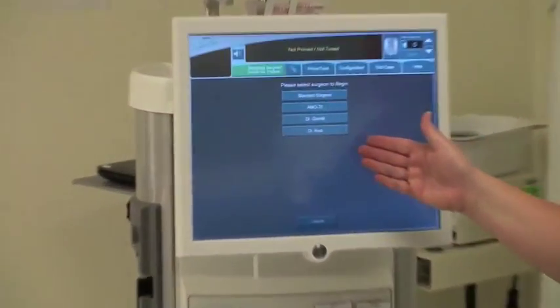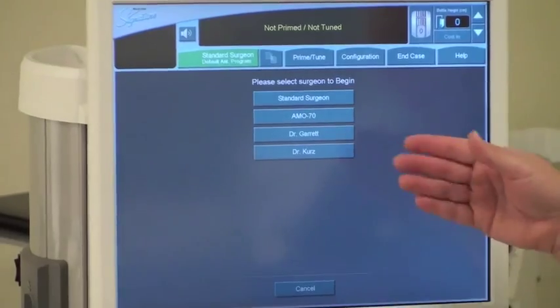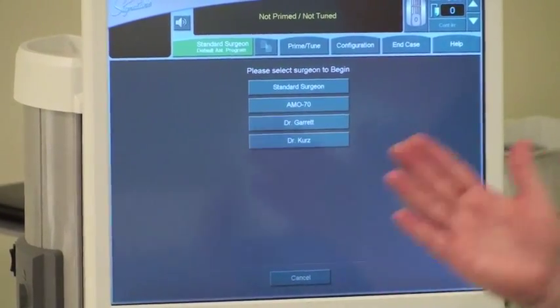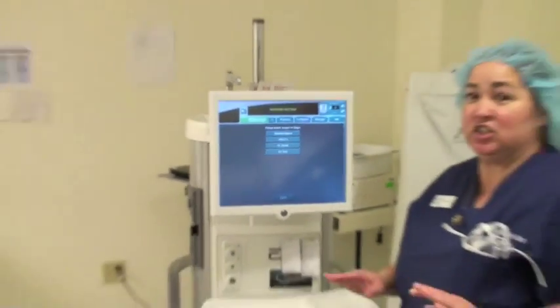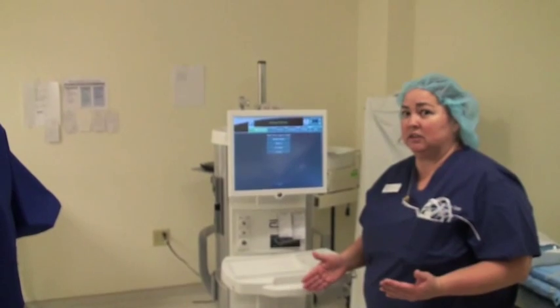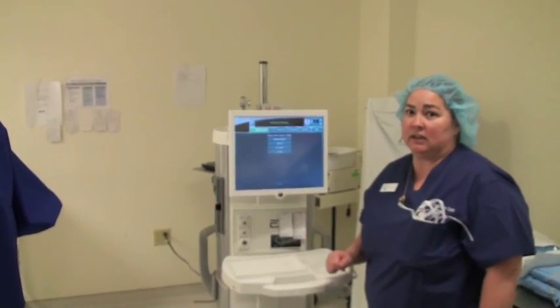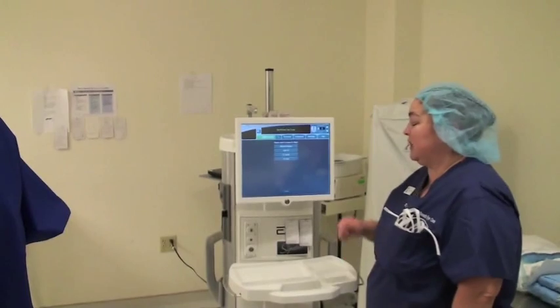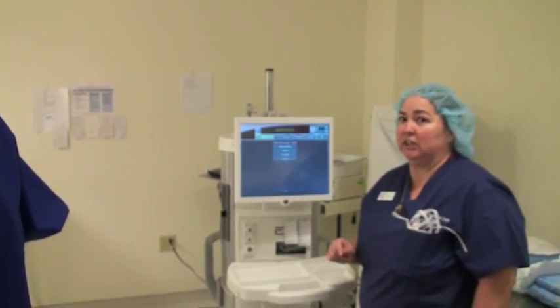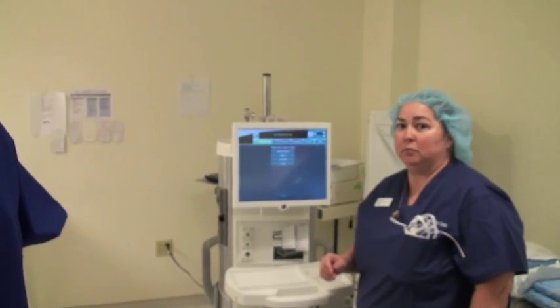It's going to come up with the programs. You can select just a standard surgeon program, and that will have all of the parameters for just a general surgeon, or whatever doctor comes to visit and is using the phaco machine. You can set it up according to their parameters, which they can download on a zip drive, and it can be loaded into the back of the phaco machine to load their parameters.